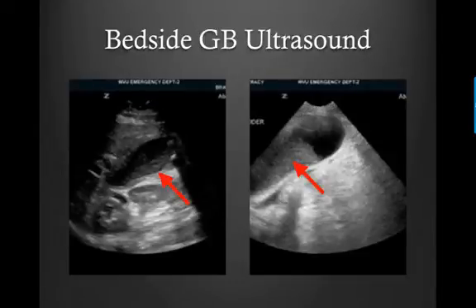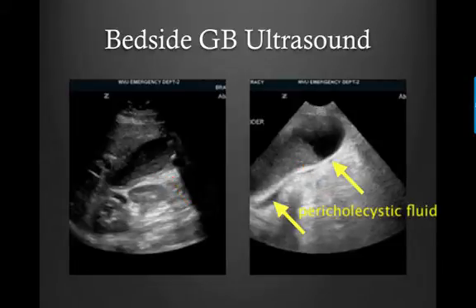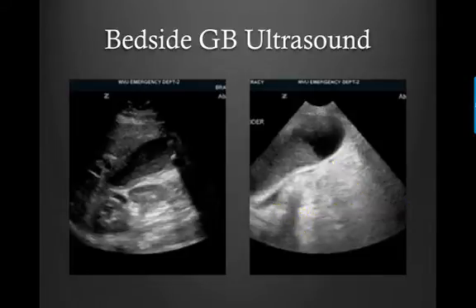Here are a few examples of sludge within the gallbladder. The gallbladder on the right also has some thickened wall and pericholecystic fluid.